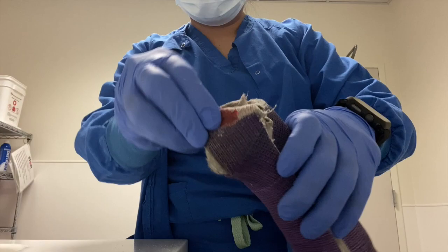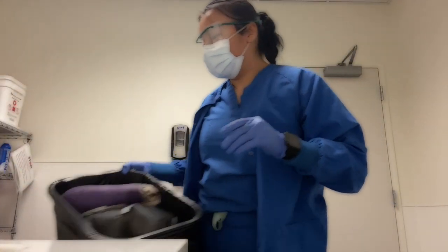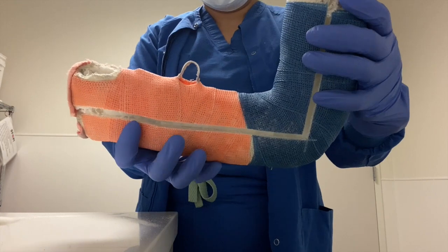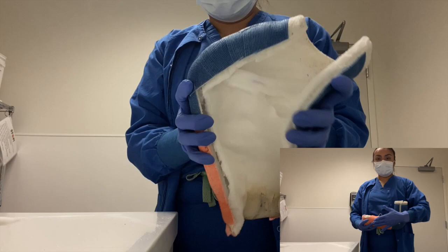Up next we have this long arm hanging cast. This is a cast we apply in the orthopedic clinic every two to three months, and it is used for humeral fractures.